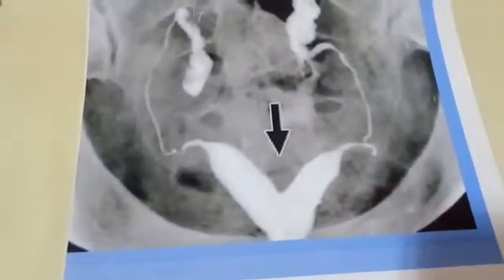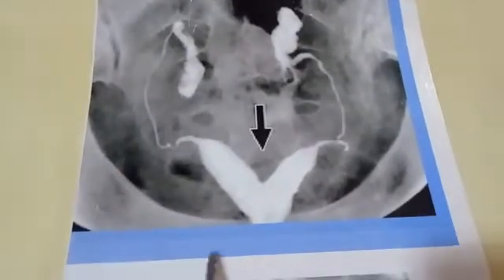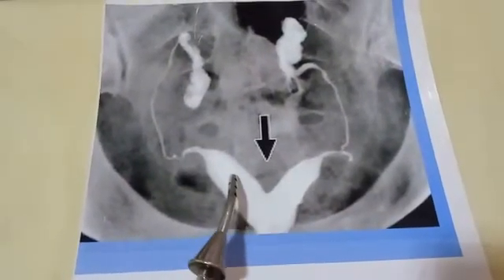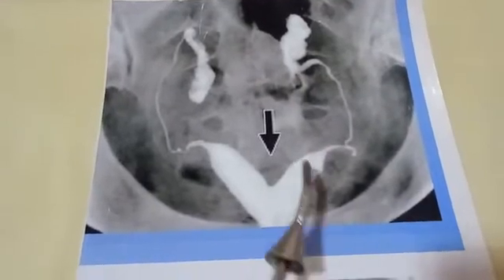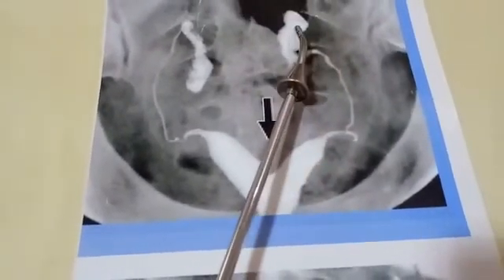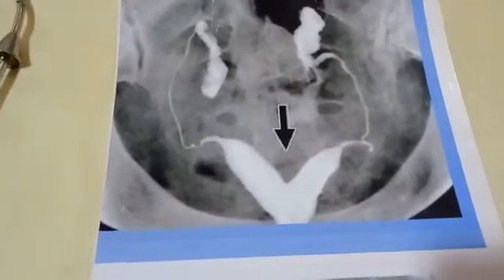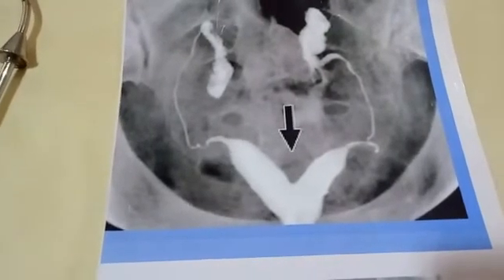Here is a full hysterosalpingography example. We can see the uterine cavity is divided into two parts, while the fallopian tube is normal and patent. The uterus here is a bicornuate uterus. In this next picture, this is a septate uterus — septate uterus versus double uterus.